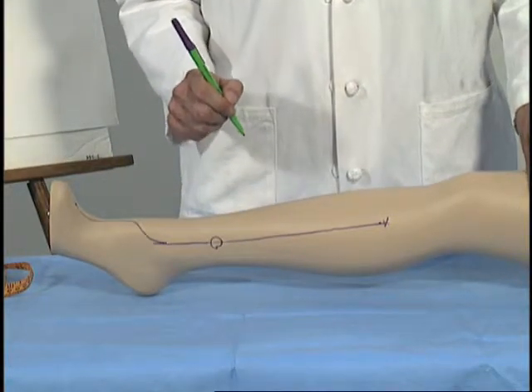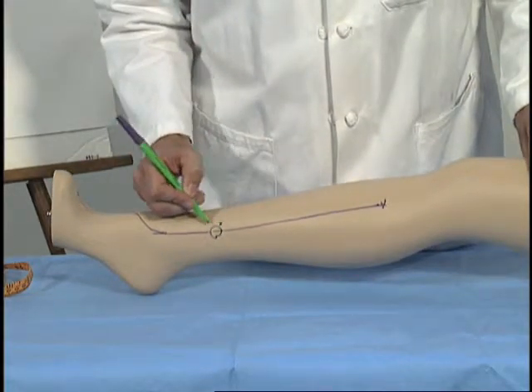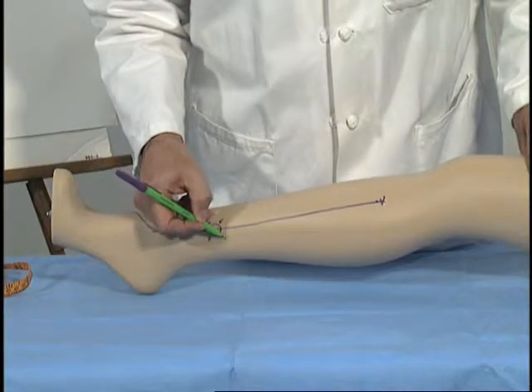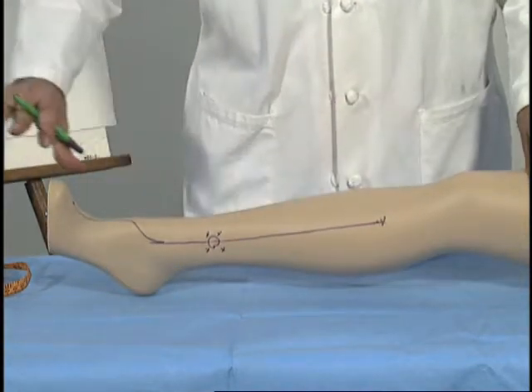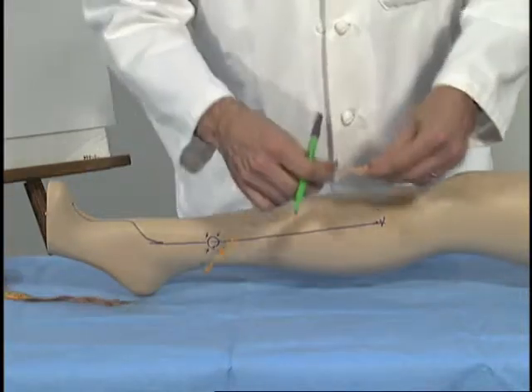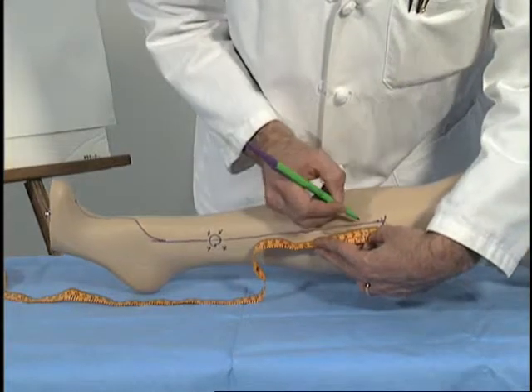count toward your total. So in this scenario, if we spaced around our ulcer at our typical 1 to 2 centimeter interval, we'd have 4 injections here, leaving us with 36 for the rest of the leg. We'll take and mark those out at 2 centimeter intervals.